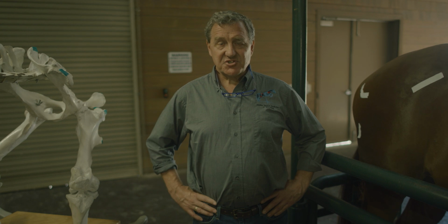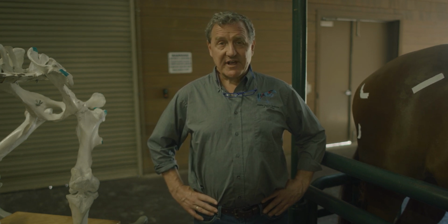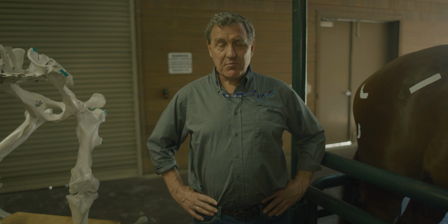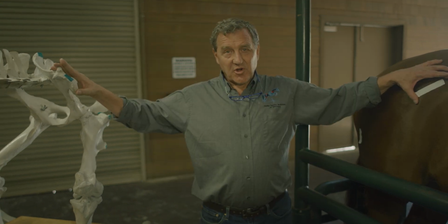The other situation that comes up is a performance issue where it might be related to a hip problem. So the hip joint will be included in the external pelvic ultrasound. But again, most of this is going to be related to traumatic situations where you're trying to eliminate the possibility of fracture. I'm going to start with the tuber coxae.